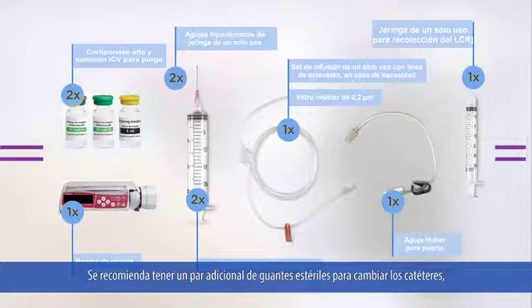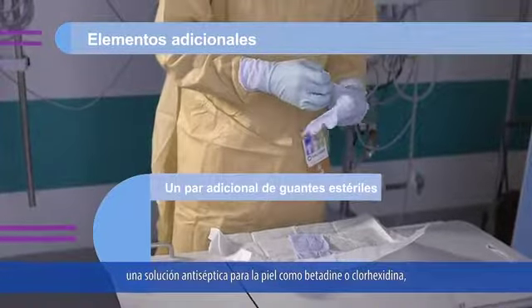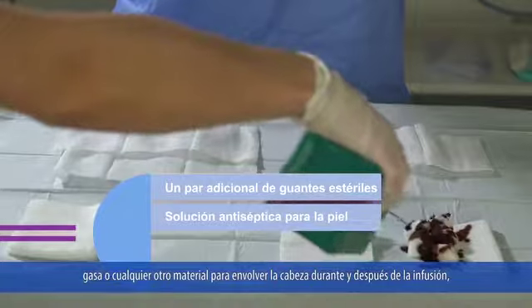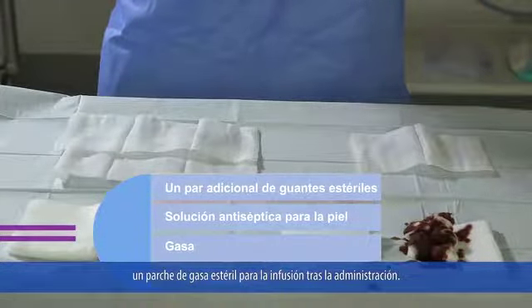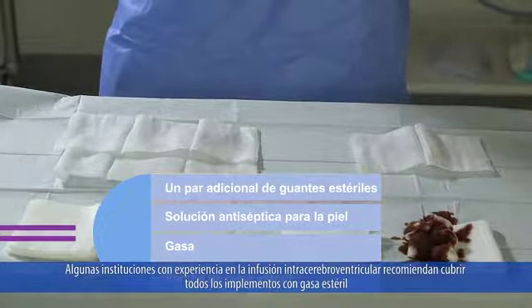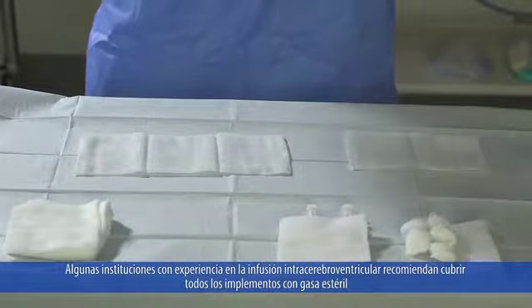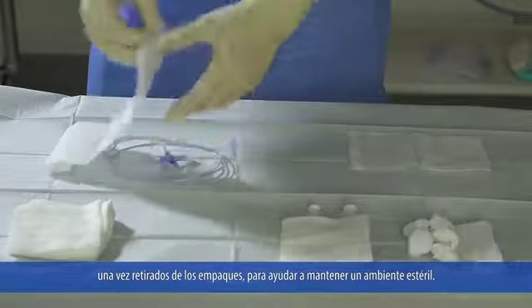It is recommended to have an extra pair of sterile gloves for changing lines, skin antiseptic solution such as betadine or chlorhexidine, gauze or another material to wrap the head with during and after the infusion, and a sterile patch or gauze for the infusion site post-administration. Some institutions experienced with intracerebroventricular infusion recommend covering all supplies with sterile gauze once removed from the packages to help maintain a sterile environment.